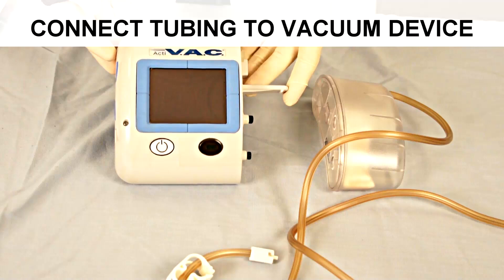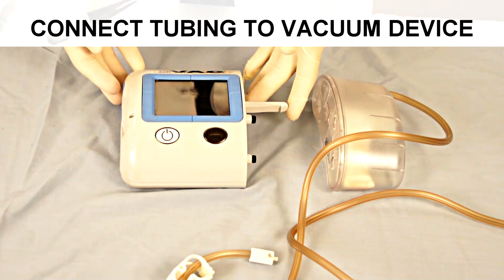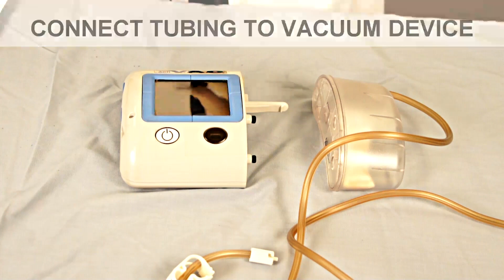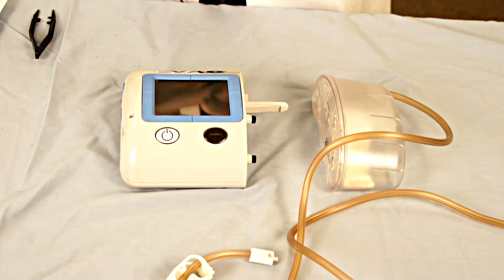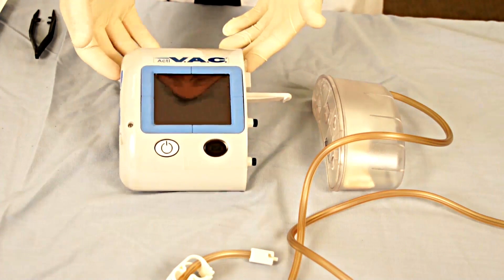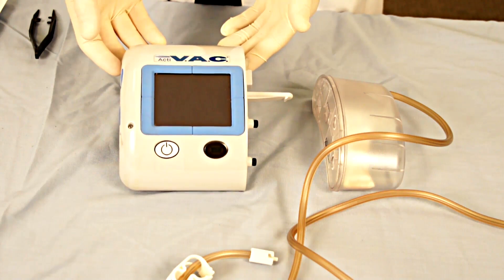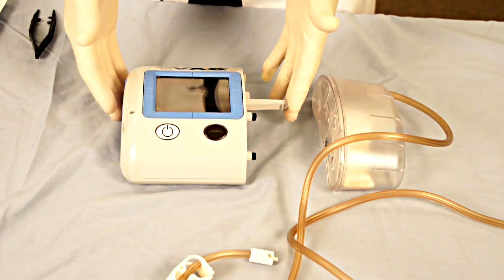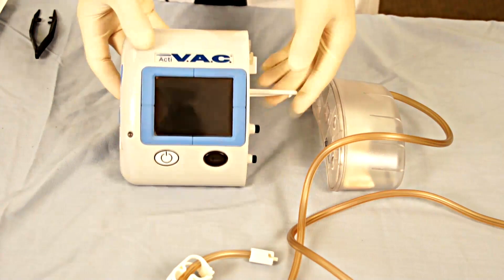There are a variety of negative pressure therapy systems. This is a KCI system known as a VAC. The VAC is supplied in a portable model that is battery operated as well as AC current operated. In addition, there are other larger units that are based on direct non-battery operated power use for different indications.